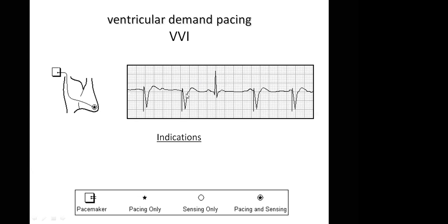Sir, so at the third beat we have on this ECG, it means that it is an intrinsic one? Exactly, and you can see that it did not pace. So it inhibited. Okay. Now, it was taking longer to see another one. That's why it paced. You get? Yes, sir. That's the mode. So you can see it's straightforward, right?